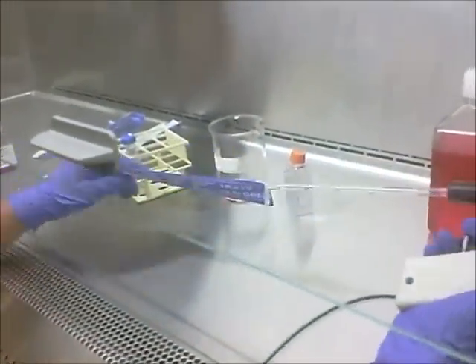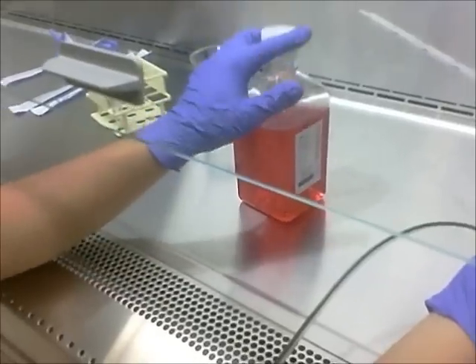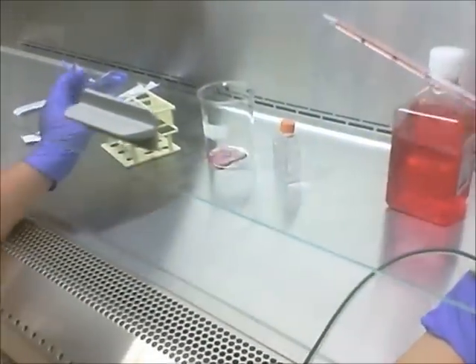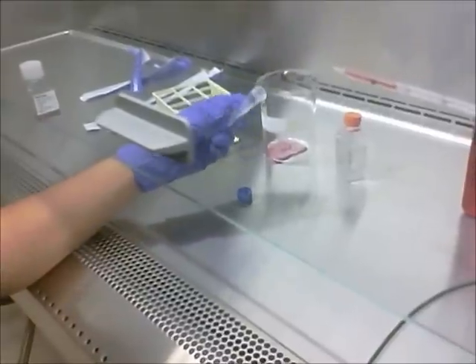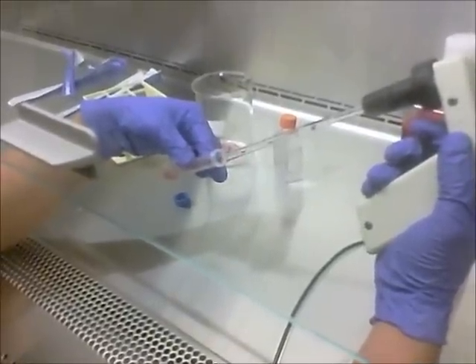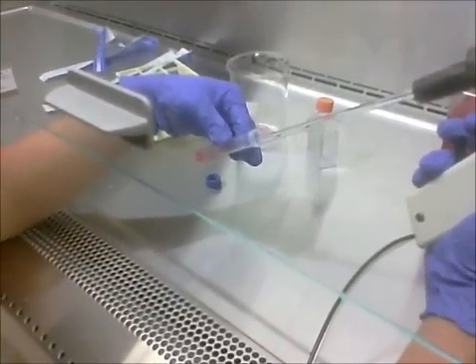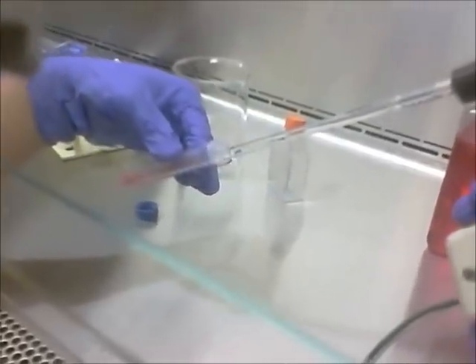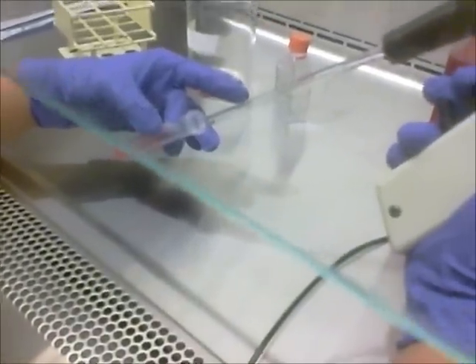Once more using a new pipette, being sure not to touch the tip to anything so we maintain sterile technique, we're going to use the designated media for mESC cells. We're going to add the media into our pellet — it's okay to put down the cap this time as we are already done with the centrifuge tube and will not be needing it further. We're going to very carefully add the media and resuspend our pellet, carefully pipetting up and down. Then we remove all the remaining contents of the centrifuge tube and transfer it into a flask.